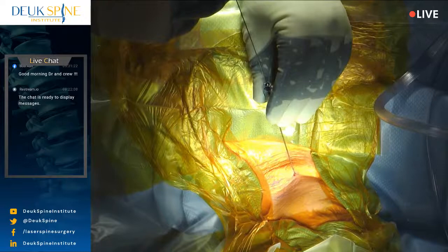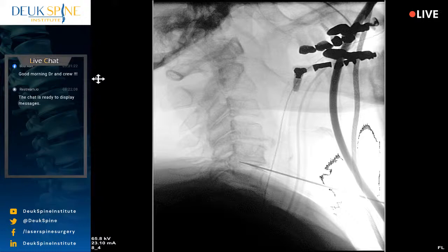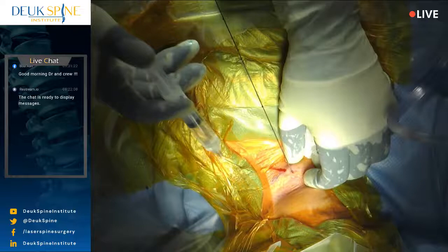Now I'm going to remove the needle and leave the guide wire. And the guide wire serves as a guide. It's kind of like if you travel somewhere and you need to find your way around, you get a guide. A guide will show you where to go and where not to go. Guides take you the best route, if you have a good guide. And this is a good guide wire. They take you the best way to get from point A to point B, from the start to the destination. Okay? Is there epi in there?